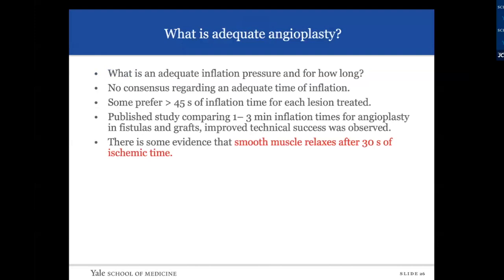So usually what people are telling me is, what angioplasty tricks do you have, or what angioplasty things do you do? And it's pretty straightforward. Usually, I like to size the vessel first, especially if I don't know the patient. I know that most of those patients will like to have about a 6 millimeter diameter, so I will mainly start with a 6 millimeter balloon if I feel like that's the appropriate size.